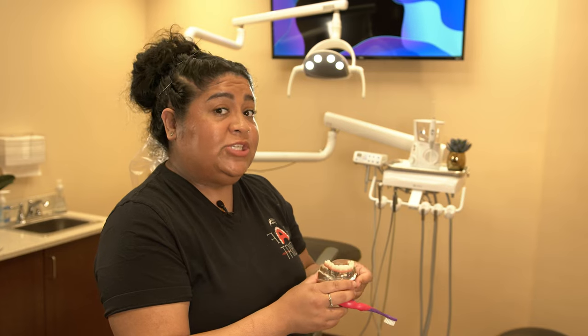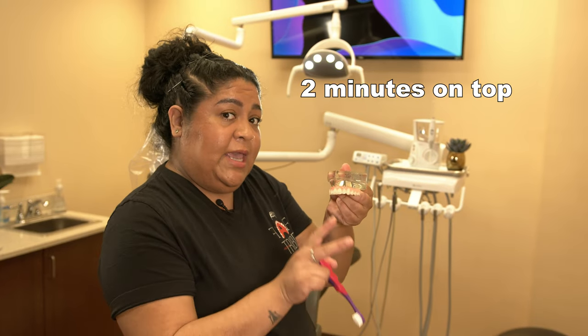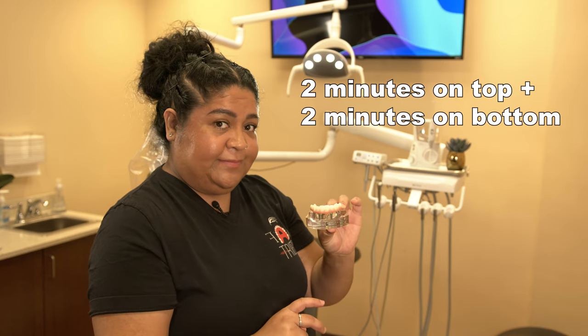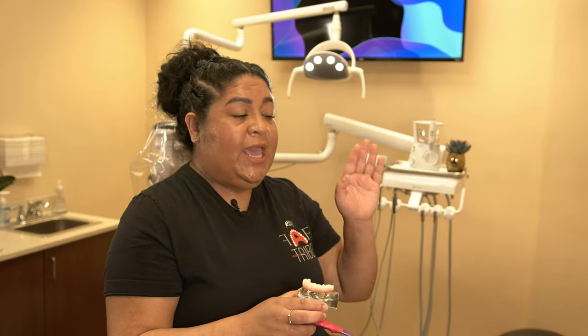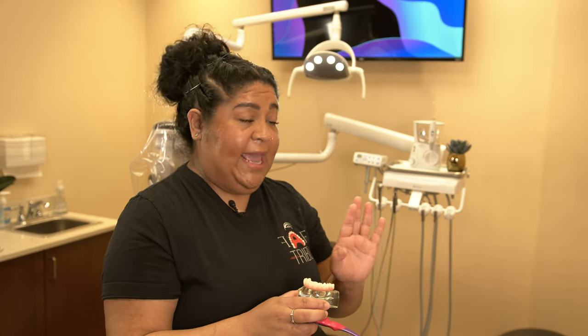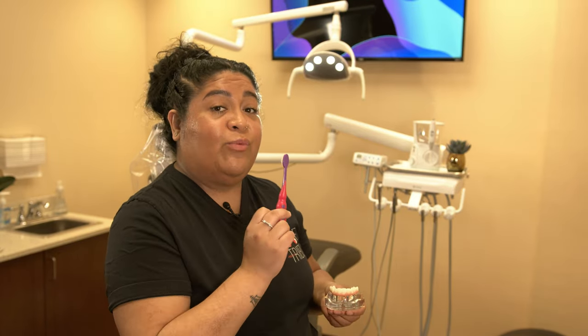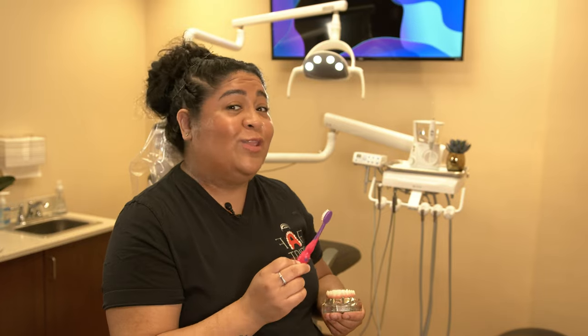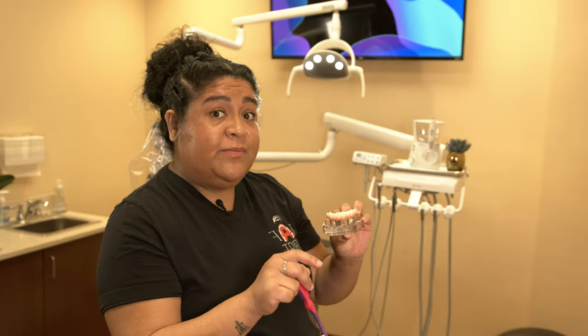Keep in mind your brushing should last two whole minutes on the top and two whole minutes on the bottom. Make sure that you don't see any plaque and don't see any debris. If there's food stuck anywhere or any plaque remaining, go right back to your toothbrush. Do not advance to your Waterpik, no matter how long you've been brushing, without everything being very, very clean.